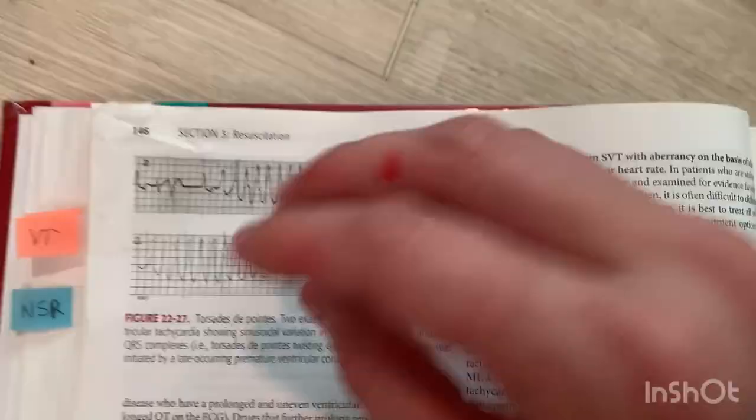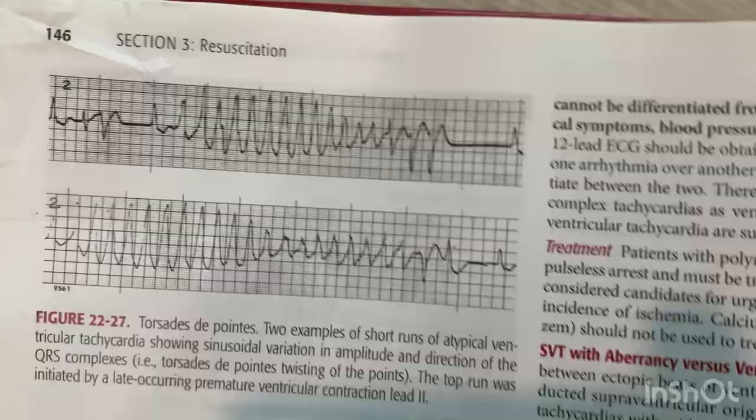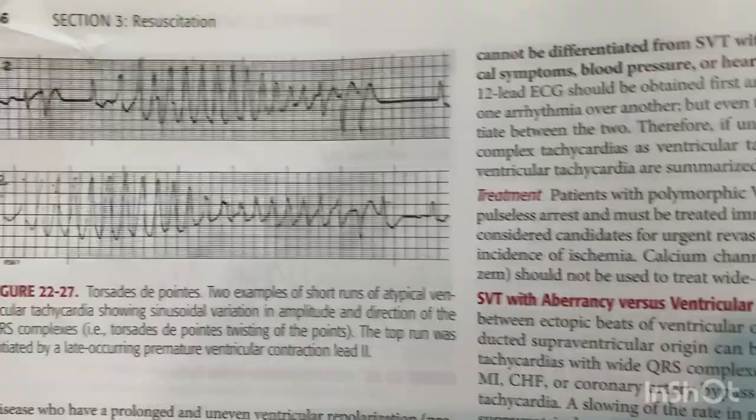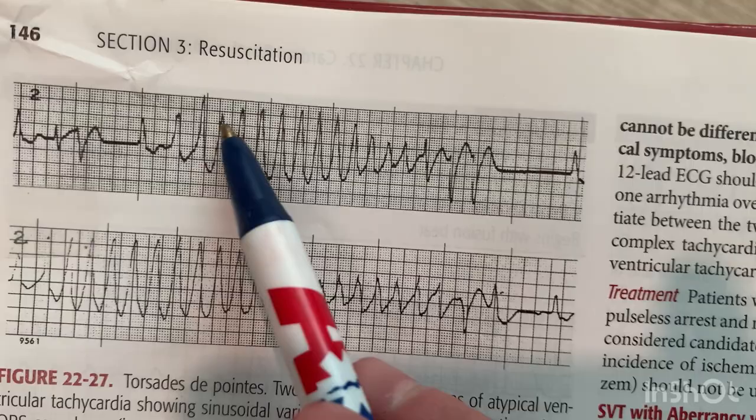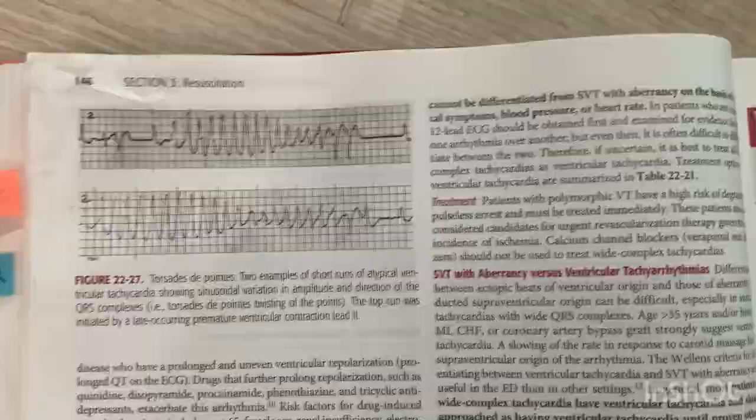Using the box method, we can look at this and say from here to here, that's roughly 300 — a little less than 300. That's how fast this ventricular tachycardia is.